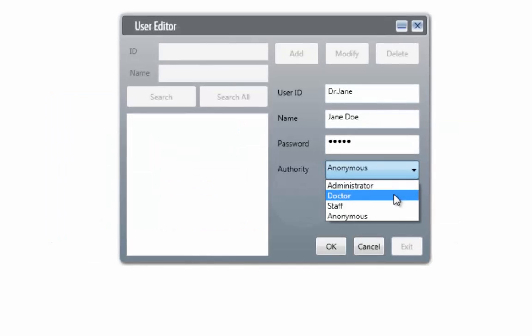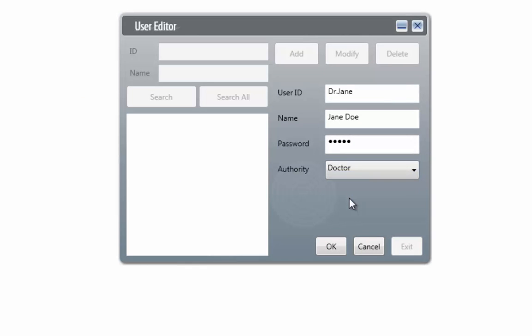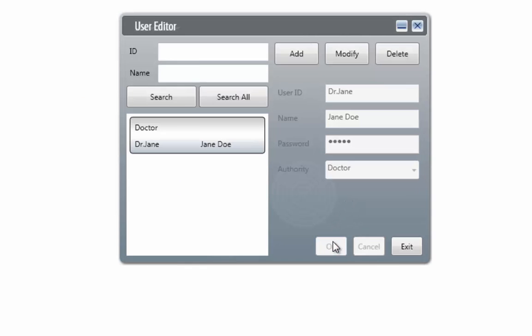When you have completed creating an account, click the OK button. As you can see, our created account is listed in the window to the left.